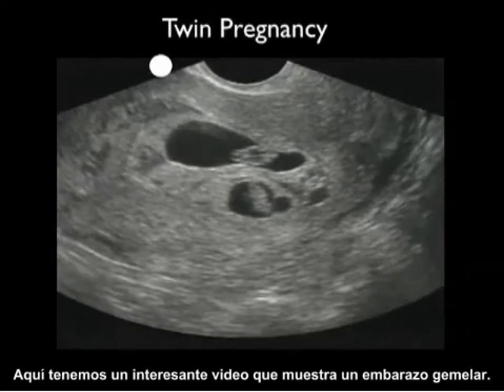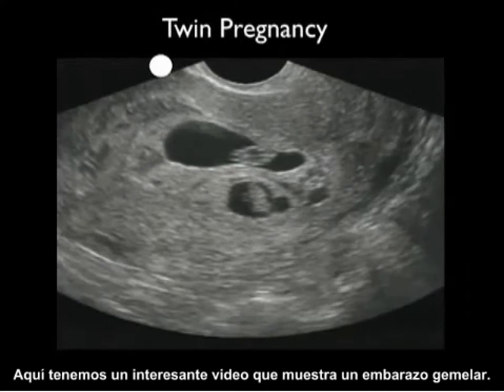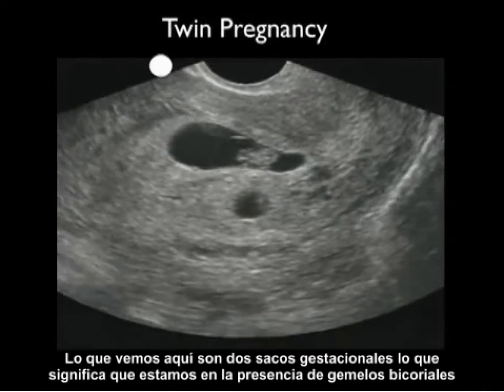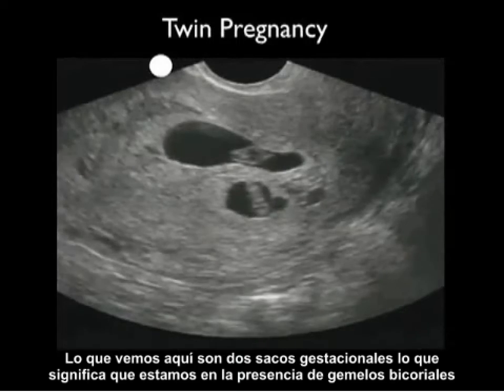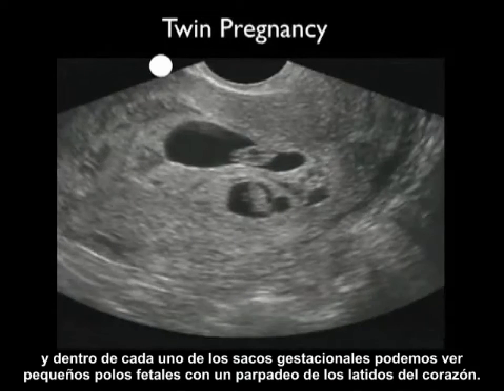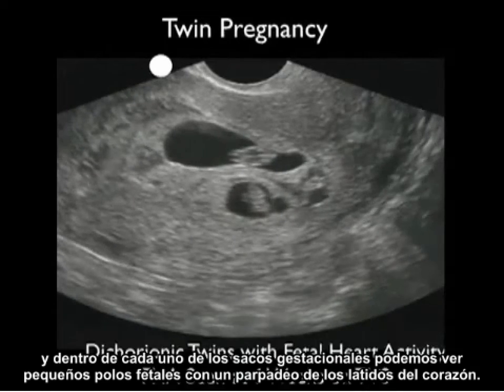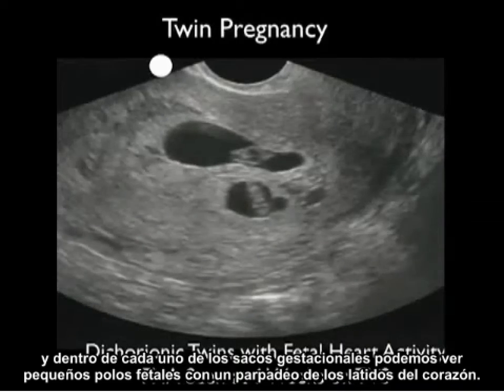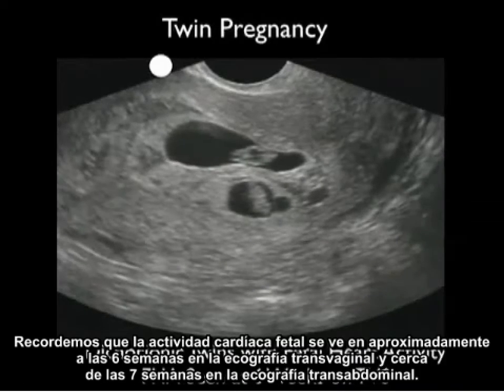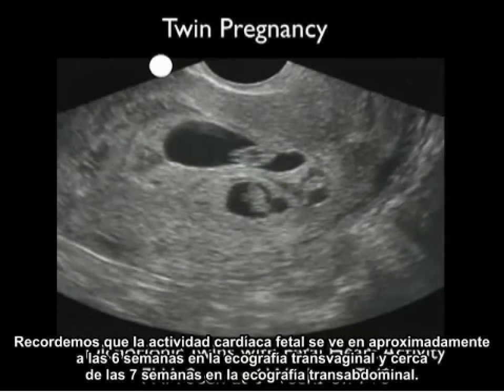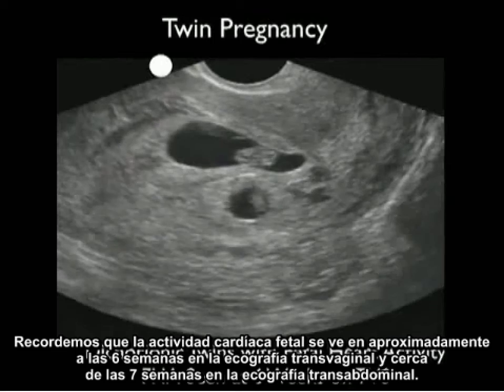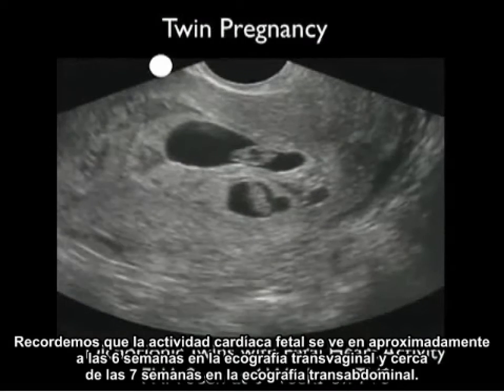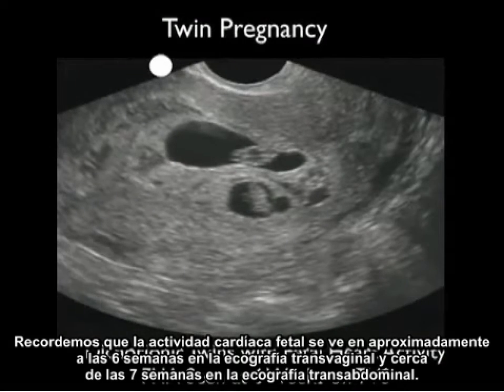Here's an interesting video clip showing a twin pregnancy. We see two gestational sacs signifying dichorionic twins, and within each gestational sac we can see little fetal poles with a flicker of heartbeats. Recall that fetal heart activity is seen at about 6 weeks on transvaginal sonography and about 7 weeks on transabdominal sonography.